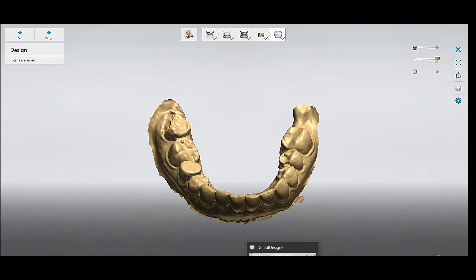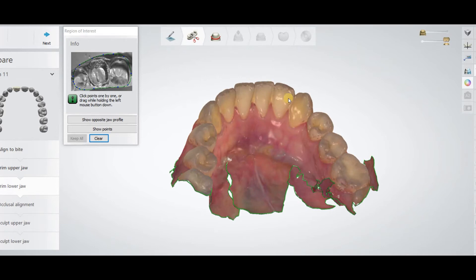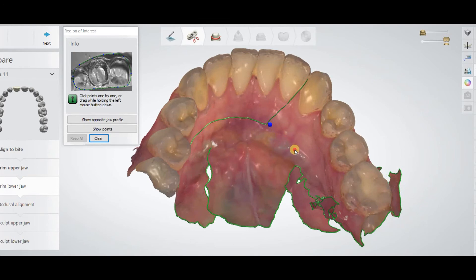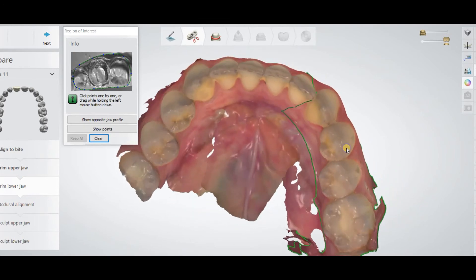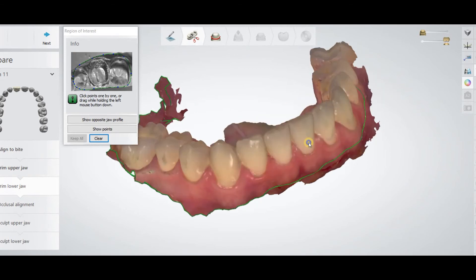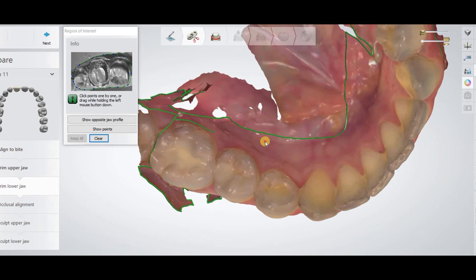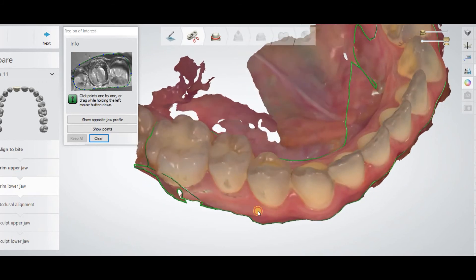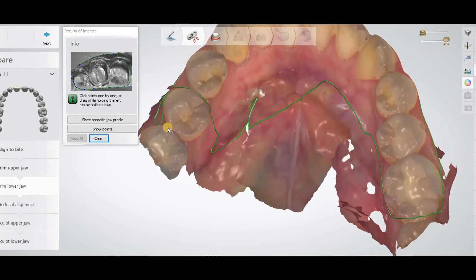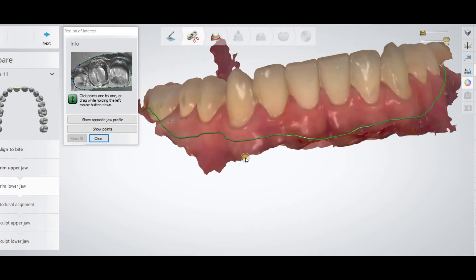Now I will show you how you can trim the scan if you have a choice. The first step is: you just draw which area you want to keep and which area you want to discard. Just draw a line around the area you want to keep. And that's all.